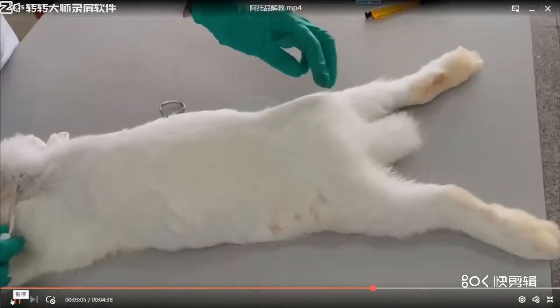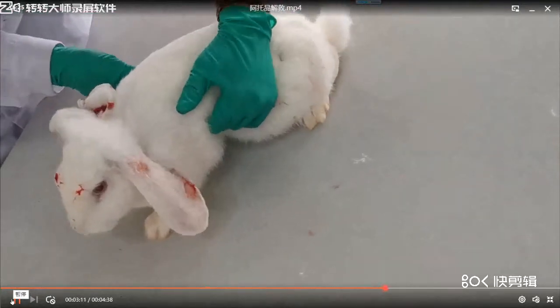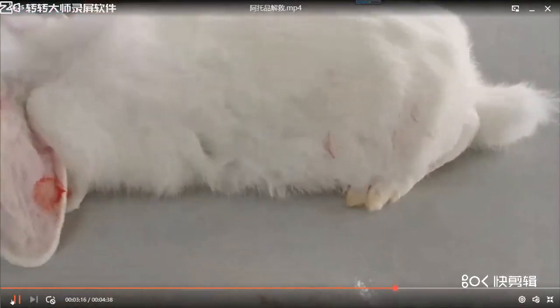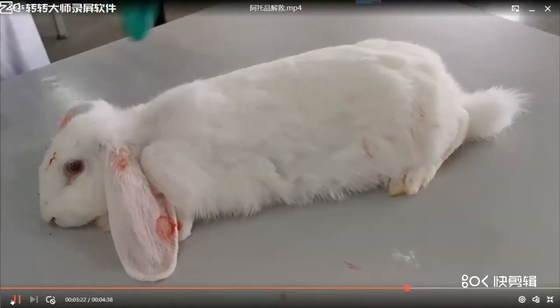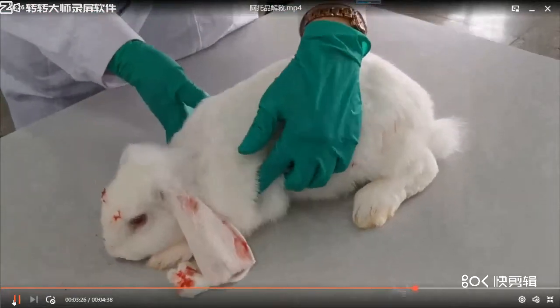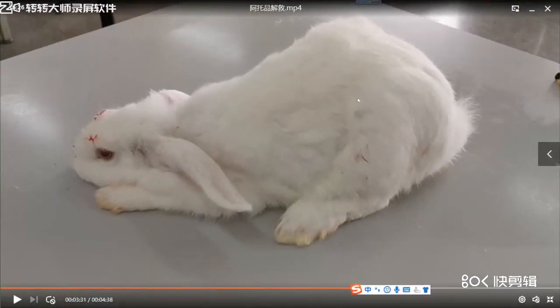Although PAM chloride has been designed to reactivate the esterase inhibited by organophosphate, clinical experience has indicated that they are not always very effective as reactivators. Thus, now we intravenously inject PAM chloride and the paralysis disappears.